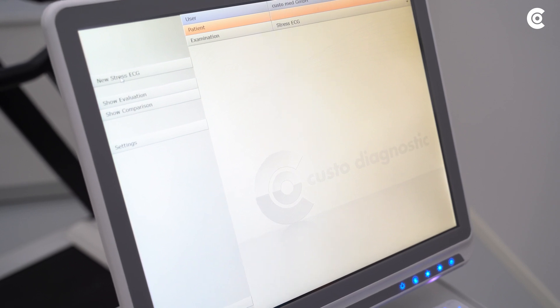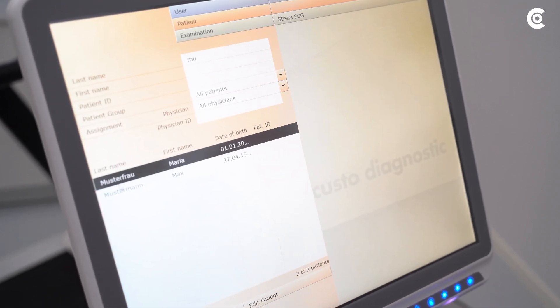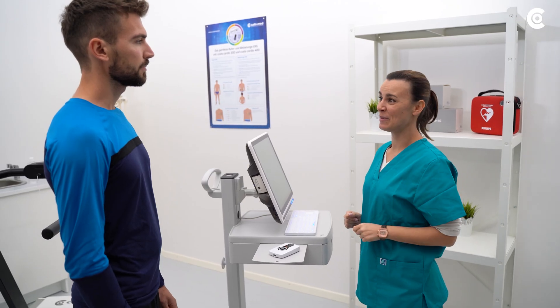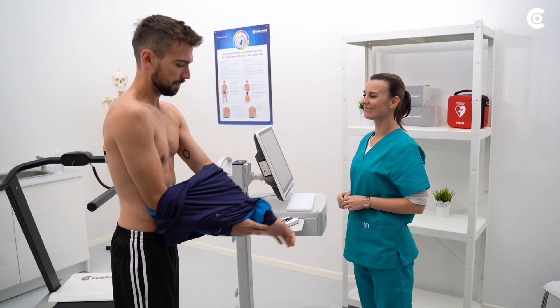First, create the patient data in Custo Diagnostic or use the already existing data. Then prepare the patient for the measurement. Make sure that the skin is free of hair or other residues.